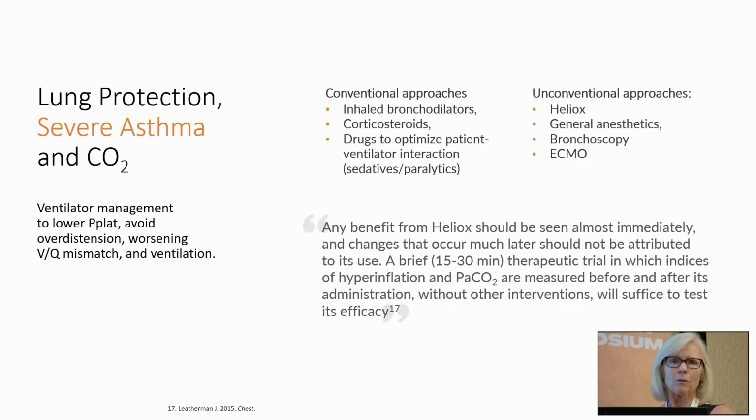Now, I talked a little bit about those patients who have asthma and how to manage them, and when you're trying to keep them from being intubated, how we're using bronchodilators, steroids, and other drugs to help relax their airways. Using continuous CO2 monitoring can really guide that.